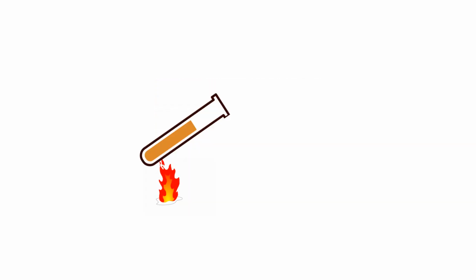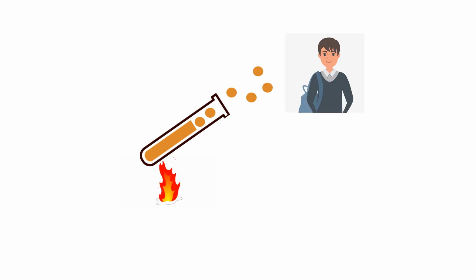Another word of caution is that there are some tests which require you to heat the test tube, such as Benedict's test that we use for glucose. When you heat some of the solutions, sometimes they can boil and come out of the test tube. So when you are boiling with your test tube, please make sure that you are not directing the test tube at any of your friends' faces, because the solution can fall off and burn your friend's face off. So don't do it, unless you really hate this person. But please.